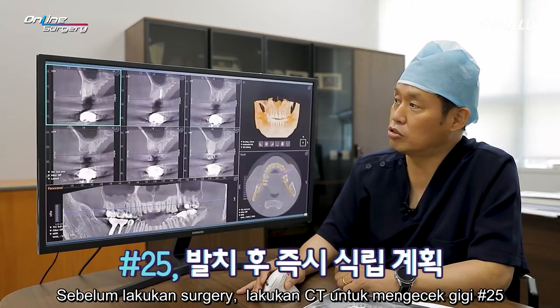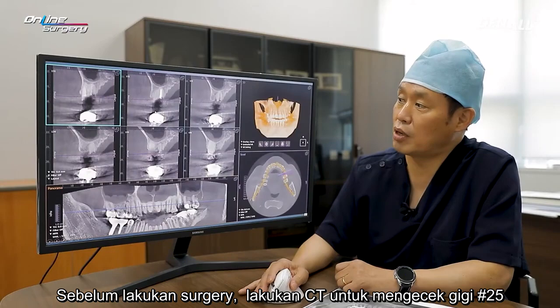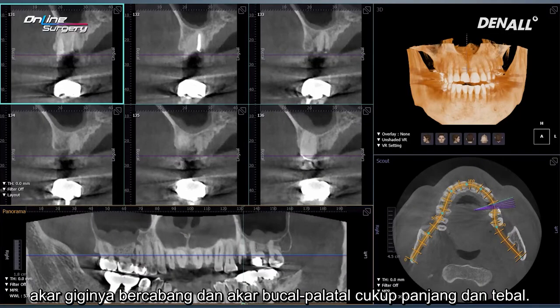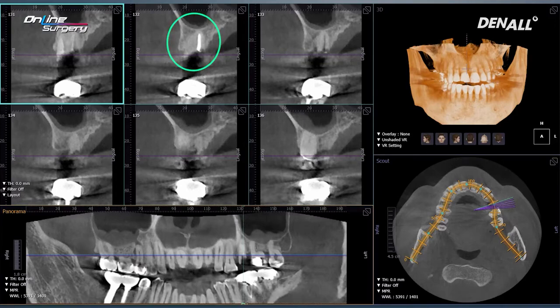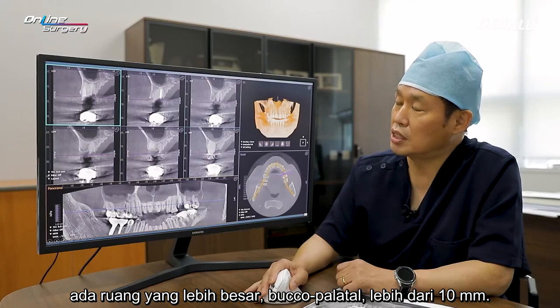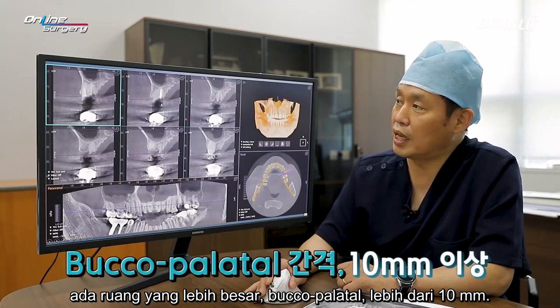Before surgery, CT was taken to check number 25. The root is divided into two. The buccal-palatal root is quite long and thick. After extraction, compared with the implant diameter, there's going to be a much bigger space buccal-palatally, over 10 millimeters.